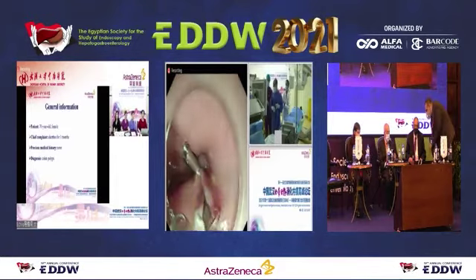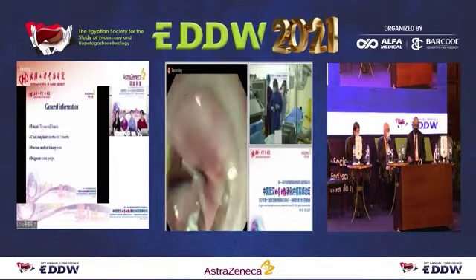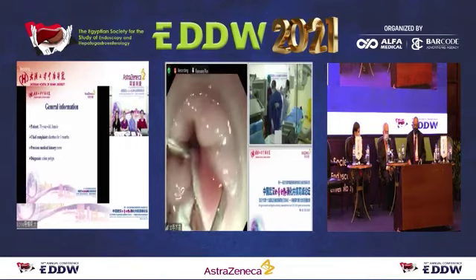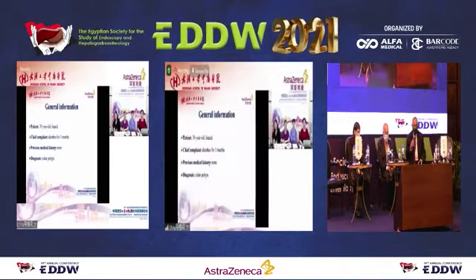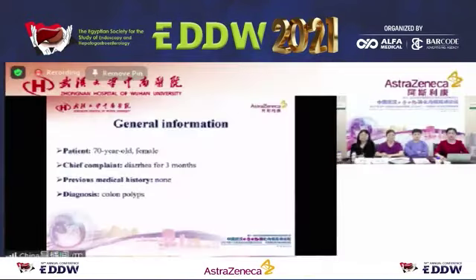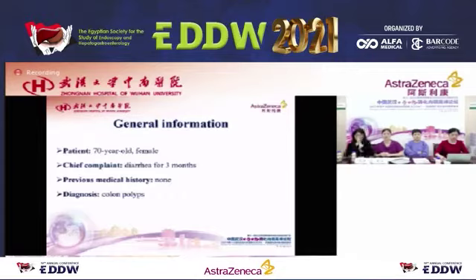Thank you, Professor Wang. Thank you for the wonderful procedure. So we'll move to the next case. Thank you very much. Excellent work, Professor, and very nice and rapid procedure. Thank you, it's very good. I've never done this before, I came to learn, so I've shown my inexperience. You will move to colonoscopy now.